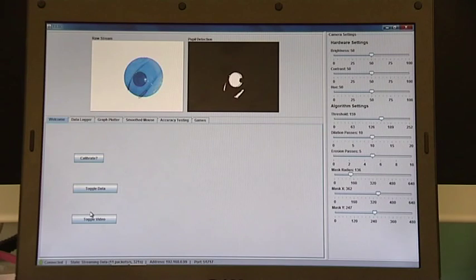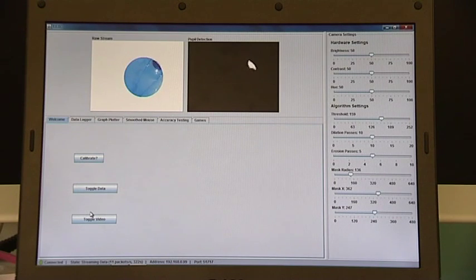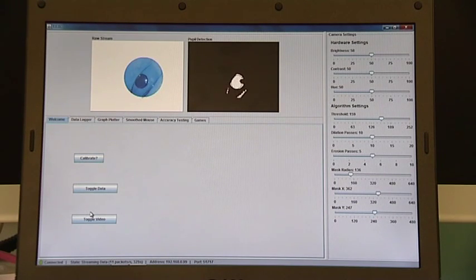If we calibrate that on a computer screen, we can basically work out where the patient is looking on the computer screen. So that's controlling a mouse with where you're looking, and it's then a fairly simple step to use that signal from this eye-controlled mouse to control a video game.